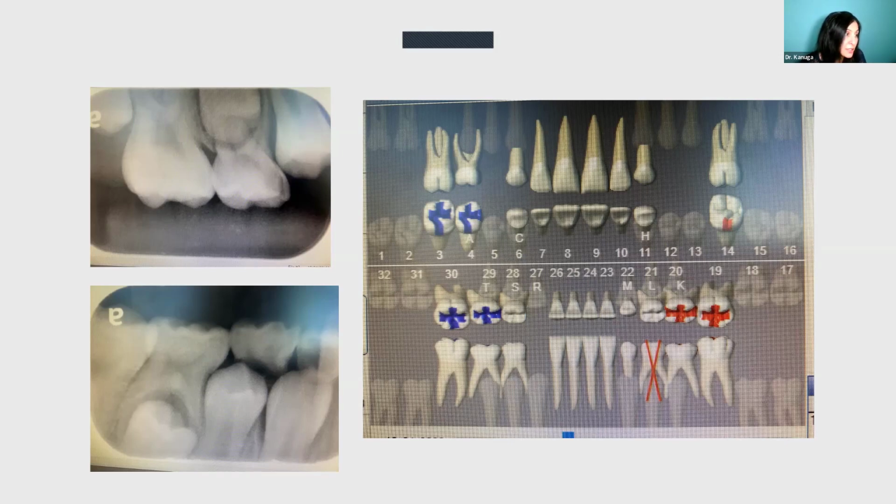So we did number 3 OL, number A MOL, number T MO, and number 30 occlusal using beautiful products with the Giomer technology, and with nitrous oxide oxygen. The patient did really well. And so she just needs to come back for the left side now.